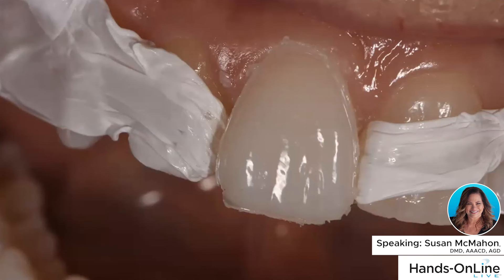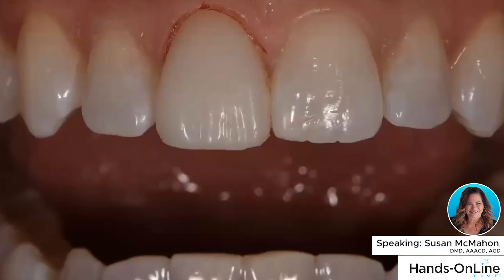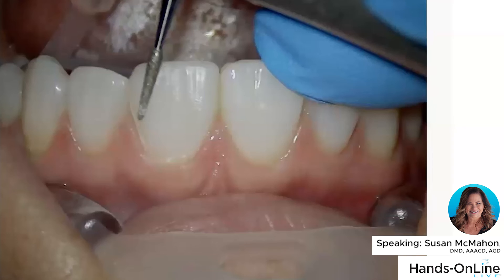Then we do the same finishing and polishing around the edges, one tooth at a time, until we've got all four done. We finish and polish the same way, and these templates have a ton of anatomy built into them. I can do four direct composite veneers like this in less than an hour, which makes it really efficient. The product is really nice — patients have appreciated it and really like it.